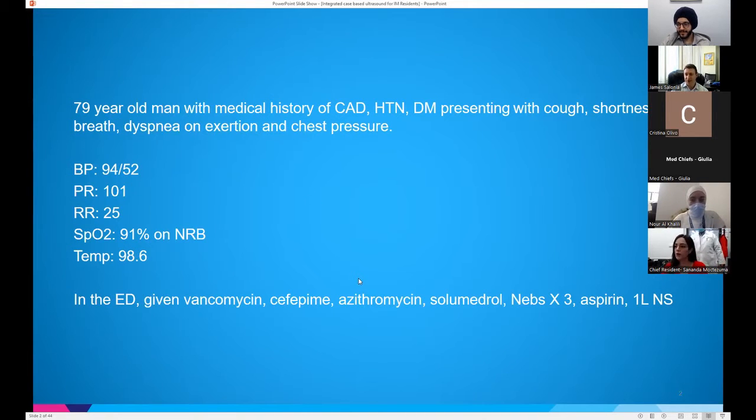So now your decision is, well, what's going on with this patient? Now you're coming down to evaluate the patient. So let's see if we can figure out utilizing ultrasound to help us make a differential diagnosis. And remember, that's what ultrasound does. It allows you to make a differential diagnosis. It doesn't point you to the diagnosis, right? This is where your clinical knowledge, your skills, your ability to interpret labs and integrate all of the information really comes into play.